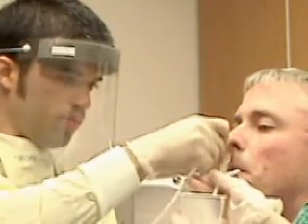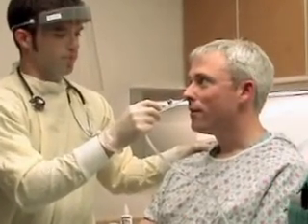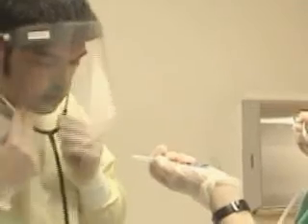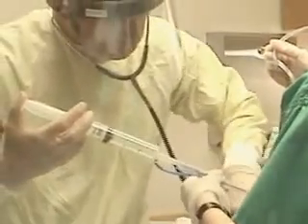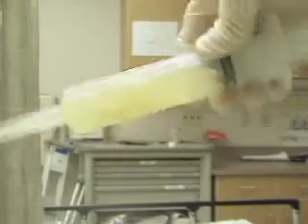Check the black markings on the tube to confirm proper depth of insertion. Assure that the patient is in no respiratory distress and is able to speak. If the patient is unable to talk, is in respiratory distress, or if respirations can be heard through the tube, it should be removed immediately, as tracheal intubation has likely occurred. Attach the catheter tip syringe to the main port of the NG tube and insufflate 30cc's of air while auscultating over the epigastrium. A gurgling noise should be clearly audible. Using the same syringe, aspirate the NG tube and ensure that it fills with gastric contents.